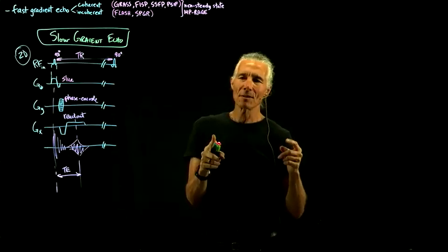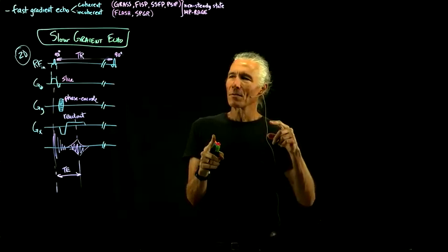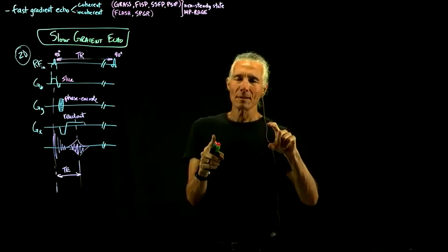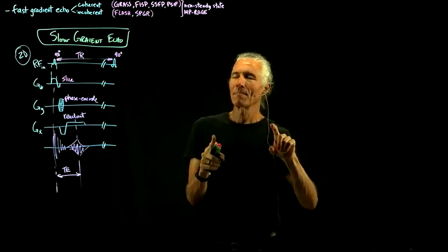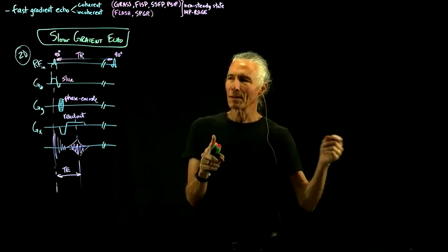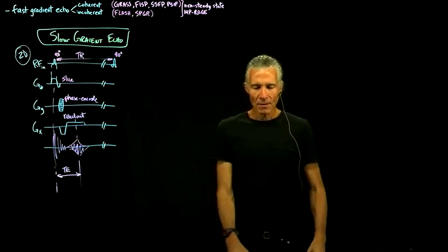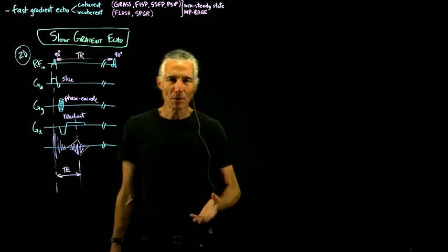But then you've still got some magnetization left, so you patch up the transverse magnetization, which might be hidden but is still there, so that you can record another echo, a train of echoes. And so the idea of GRASS is, why don't we do the same thing with a gradient echo?